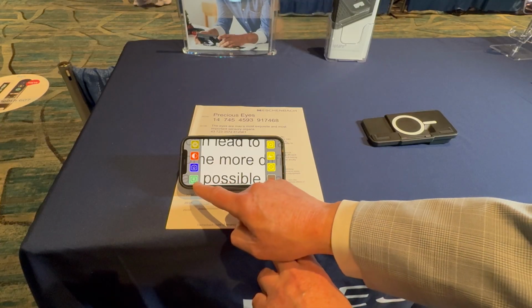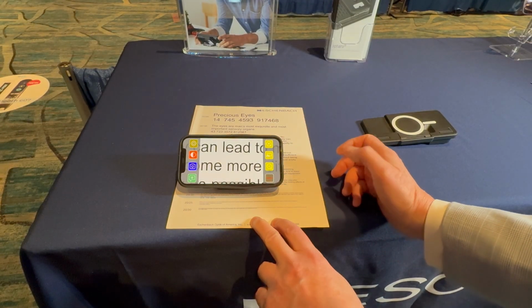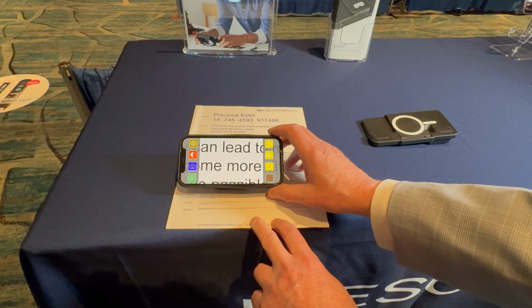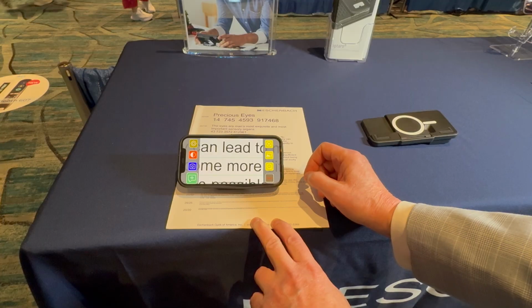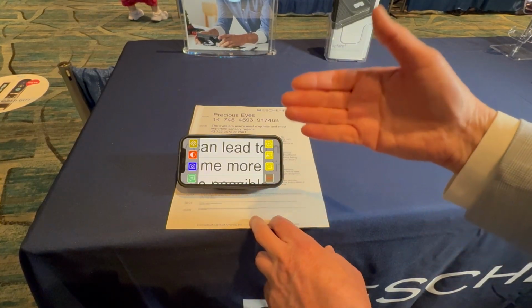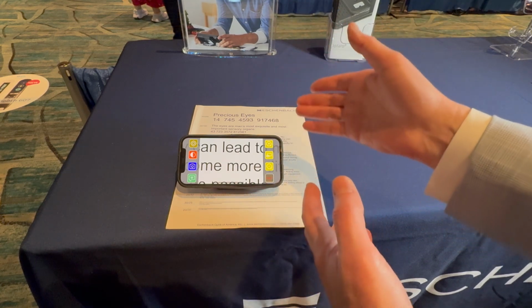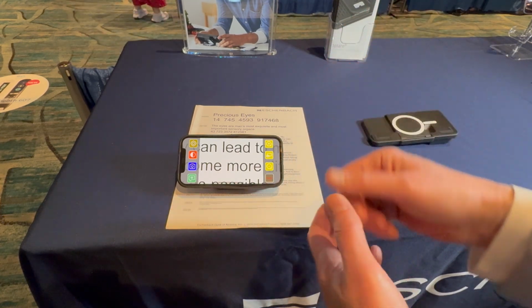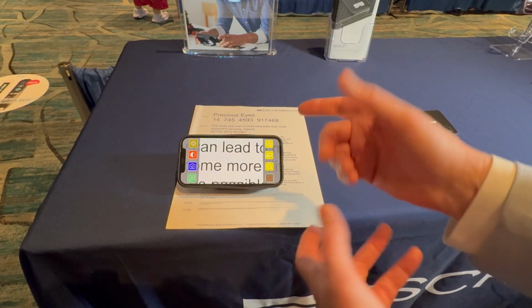Going around to the bottom of the other side is a green button, and that's what I like to call a single line OCR button. So basically it reads the text that's in the middle of the screen. So you tap it, and she says some more. So we recognize that if a person needs full OCR capability, they can just swipe out of the Optaro app and use another app like Seeing AI that can be used to scan the whole page. This is just meant for a phone number that needs to be read, or maybe a word that is difficult to read.